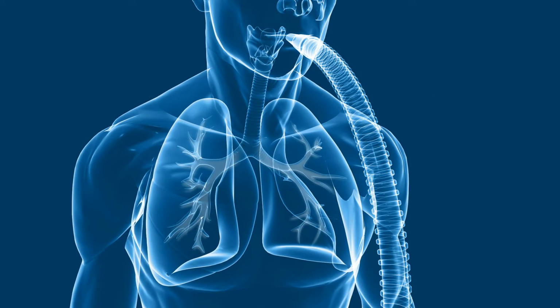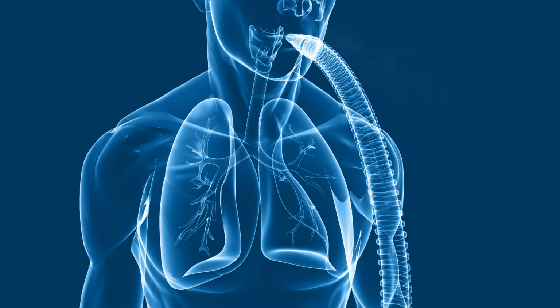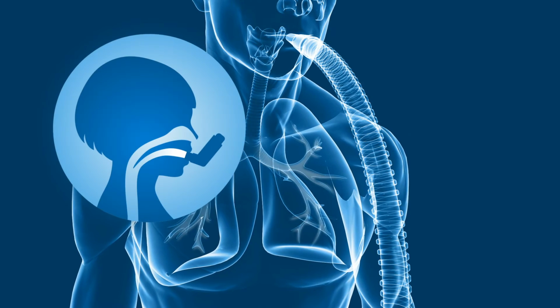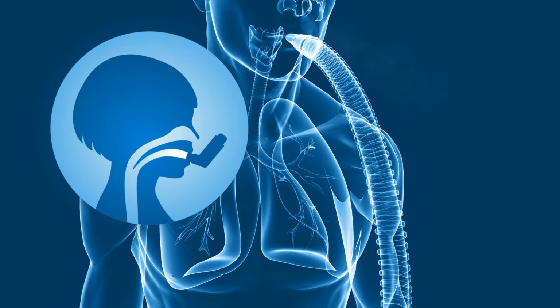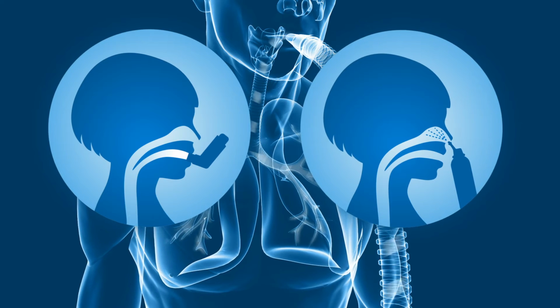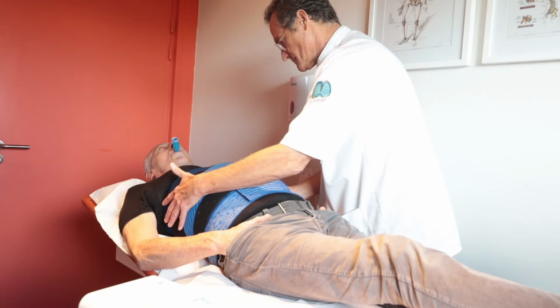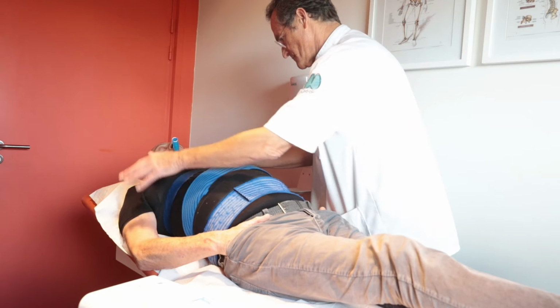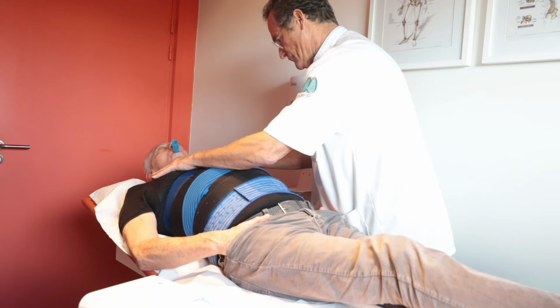There's no effective drainage if the mucus is not mobilized. This depends on prescribed bronchodilator and/or anti-inflammatory and/or mucofluidifying inhaler therapy, cleansing of the upper airways, nose washing, and state of relaxation and comfortable patient installation. Being able to achieve homogeneous inspiration, transport air behind the mucus, and avoid premature coughing are essential conditions for the success of Simiox therapy.